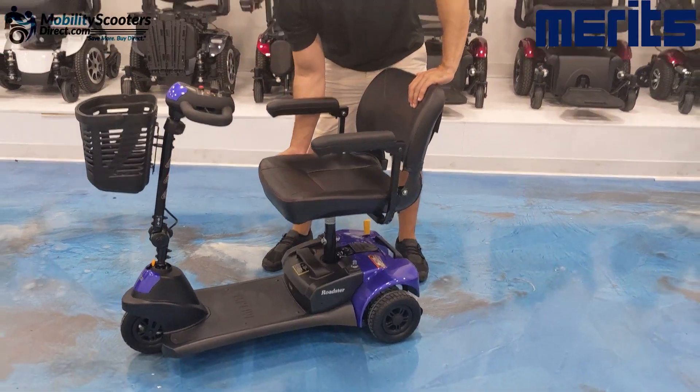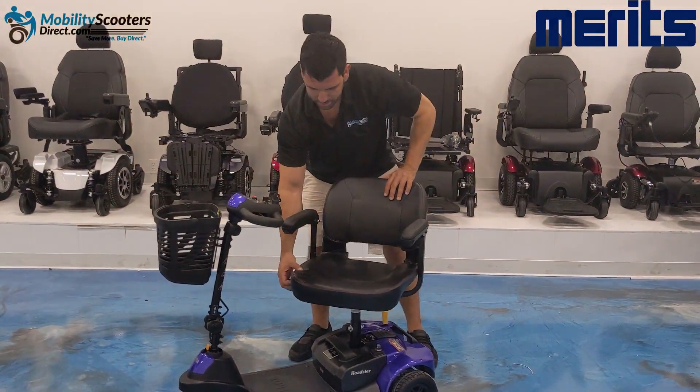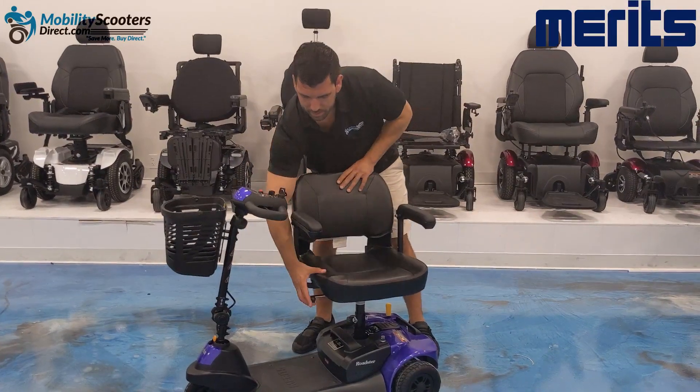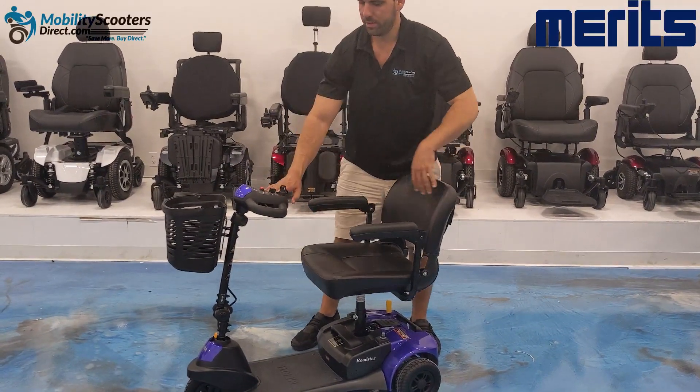You can also rotate the seat using the lever on the right-hand side — simply lift it up and then rotate. The chair will lock into position; it has eight different locking positions.